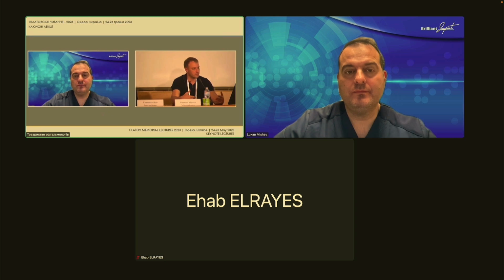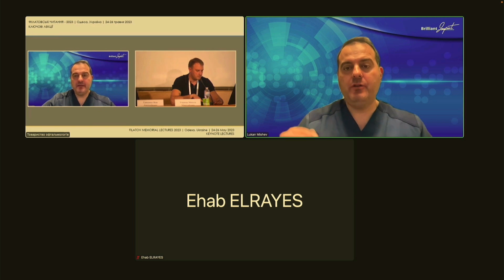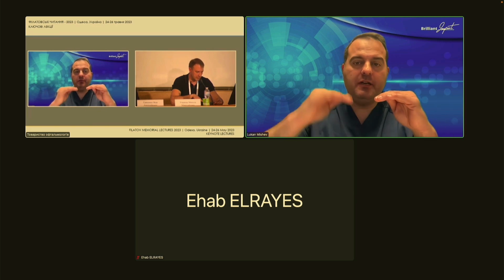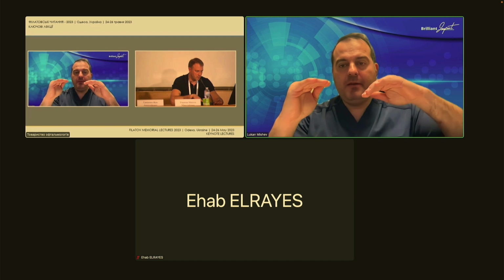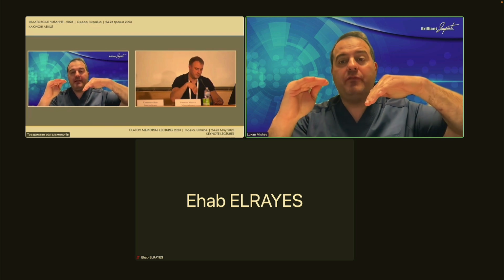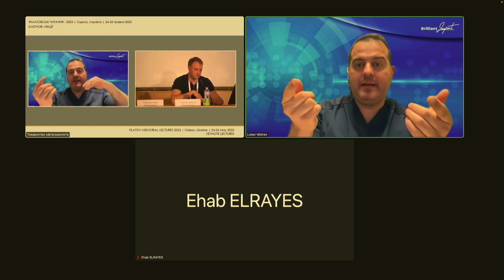Do you try to change it, or do you know how I can solve this problem? Yeah, this is related to the dynamic range of the system, as I showed on the previous slide. There is a certain level above which the sensor produces only white light, meaning that when you are close to your instruments, you reach the upper limit of the dynamic range. So you just need to pull up and keep the probe of your light more vertical, and rely more on reflected light than direct light.